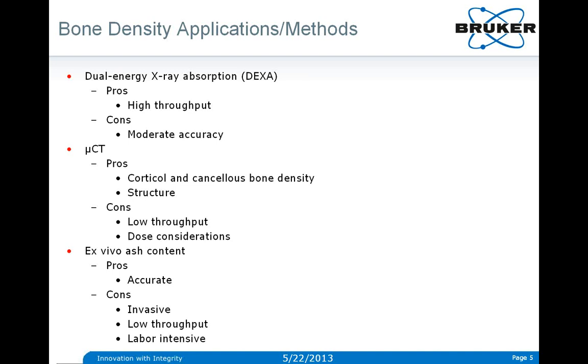An additional drawback is dose considerations. With a multi-projection acquisition where we're acquiring multiple X-rays at multiple projections, the dose can start to accumulate. This is particularly important where you're performing longitudinal acquisitions, where you perform a multi-projection acquisition over time. So that does have to be considered.